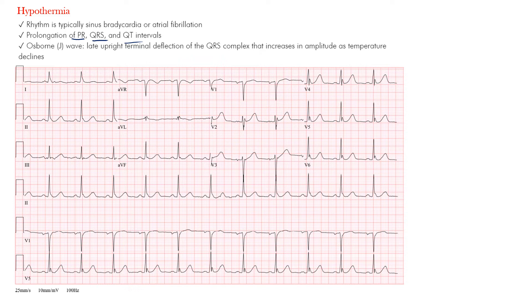The main thing to be aware of is that things slow down. Whether it's the arrhythmia — all become bradyarrhythmias — whether it's sinus brady, AFib with slow ventricular response, a slow junctional rhythm, or even an AV block. The intervals tend to get longer. The main feature is this Osborne wave: that upright terminal deflection at the J point, and it increases in amplitude as the temperature declines.